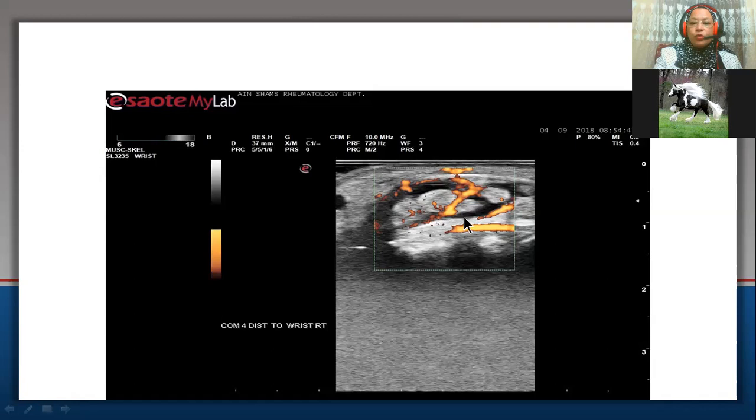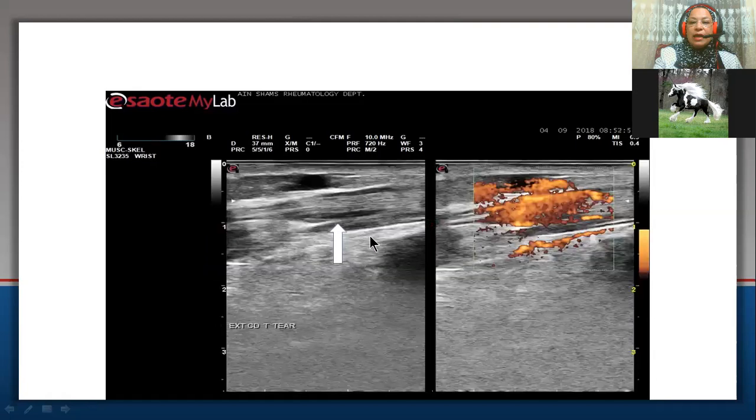Please don't miss counting the tendon slips, especially in the presence of pathology, either at the tendon sheath or the tendon itself. For example, here 1, 2, 3, 4 slips of extensor digitorum tendon together with a small slip for extensor indicis. These are the tendons present at compartment 4. But at the same time, please don't forget to follow the tendon proximally till its myotendinous junction.